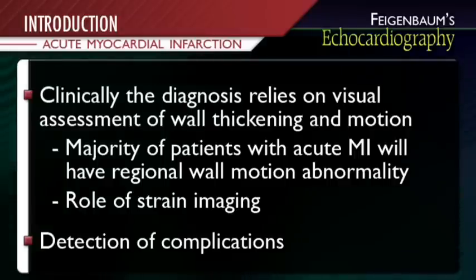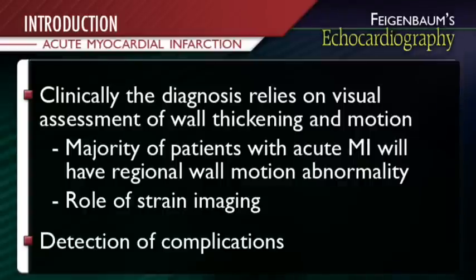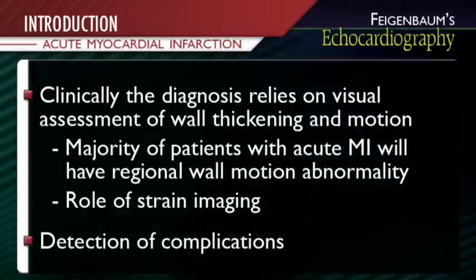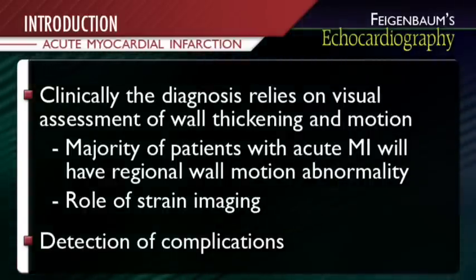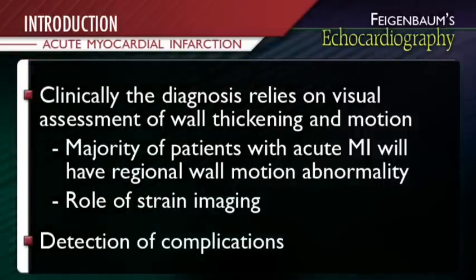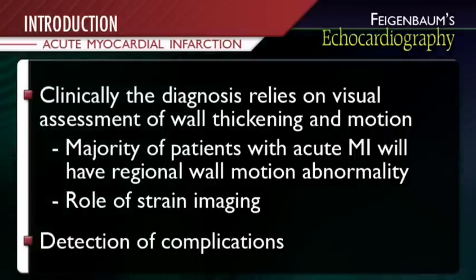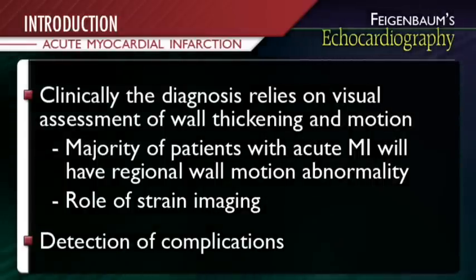Detailed methods for evaluating ventricular mechanics, such as strain and strain rate, have shown increasing promise for detecting lesser degrees of ischemia or infarction. Echocardiography can provide prognostic information and also is accurate for the diagnosis of virtually all mechanical complications of myocardial infarction.